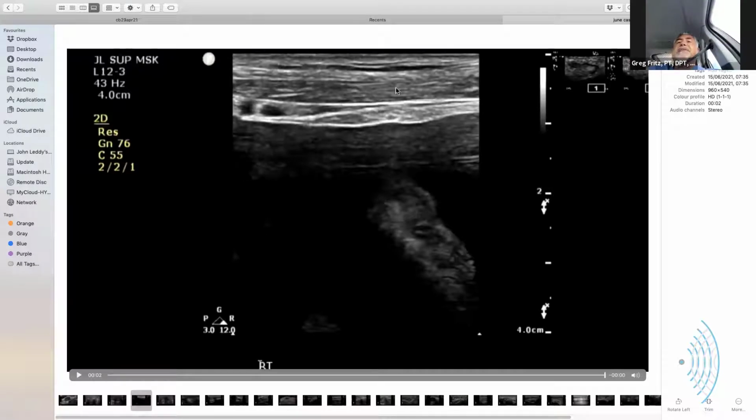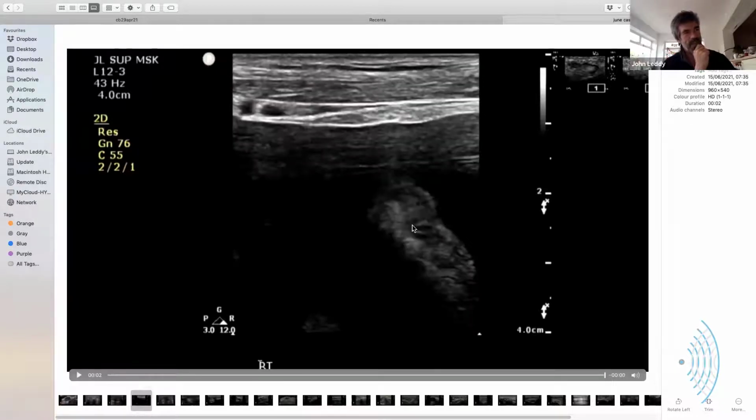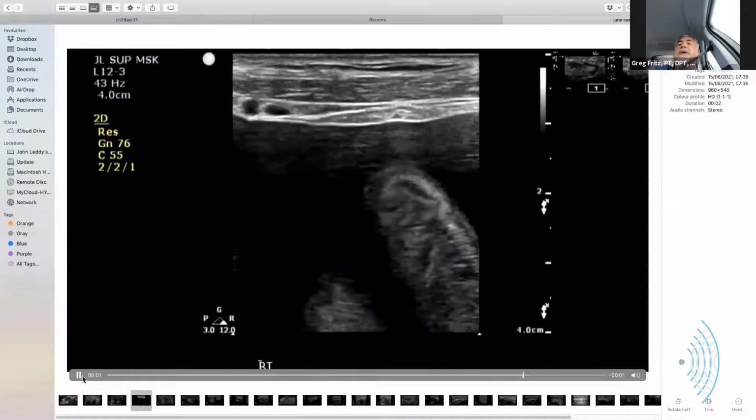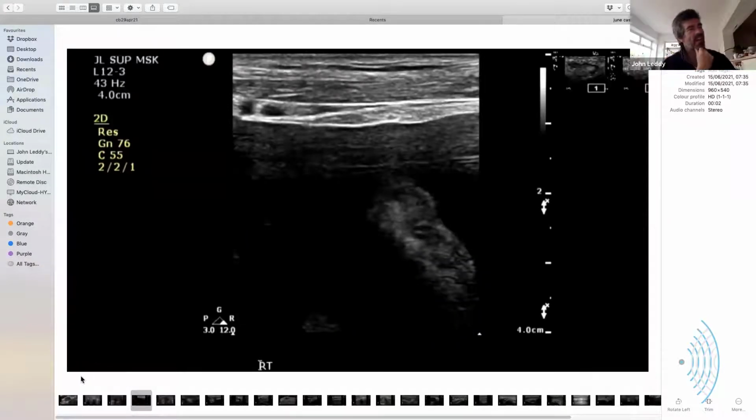I mean, I can see some vessels. Like I see abdominal wall. These are probably the inferior epigastric vessels, and this is an ascites, and that's a loop of bowel. My land, John. So that's fluid filling the tummy. Yes. And a little loop of bowel.